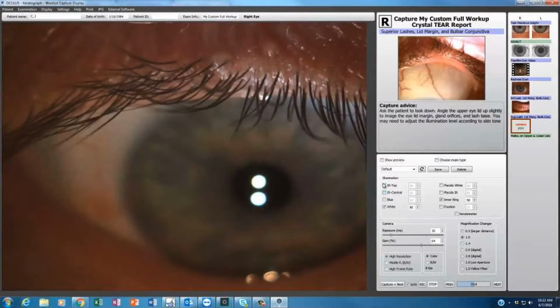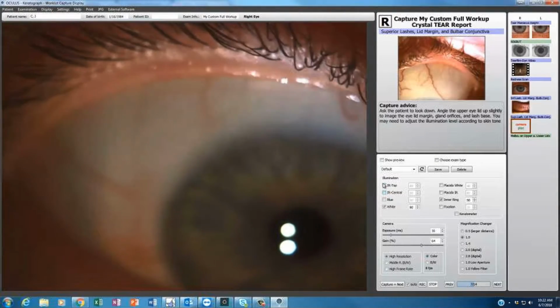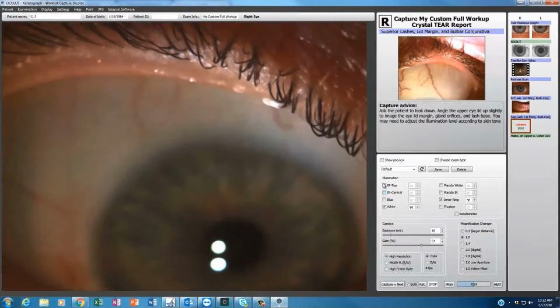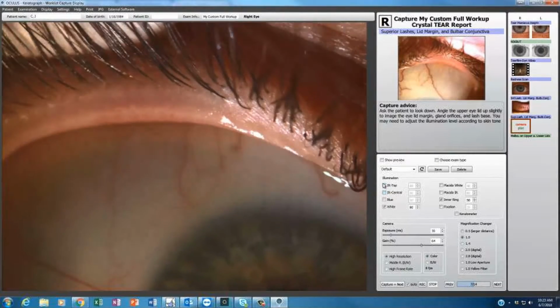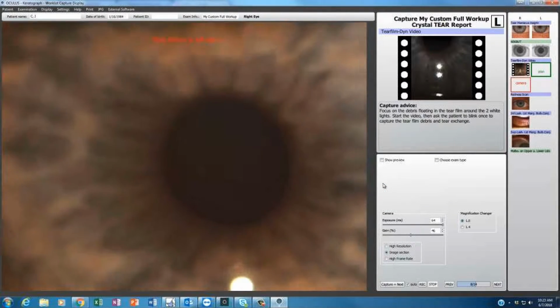I'll let this whole video play out so that if you do want to go back and review the recording, it's there. So in the lid pictures, you can take it with the lid closed, do it like you're doing now, snap a picture, and just move it wherever you need, however many times.